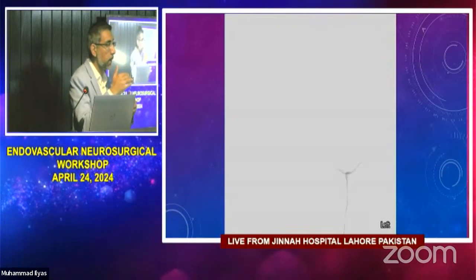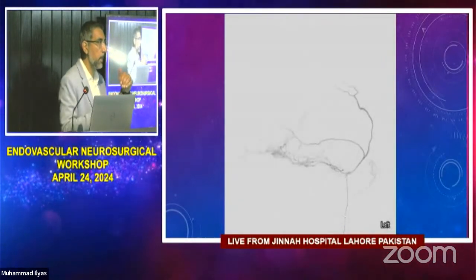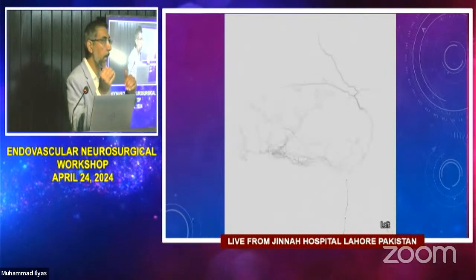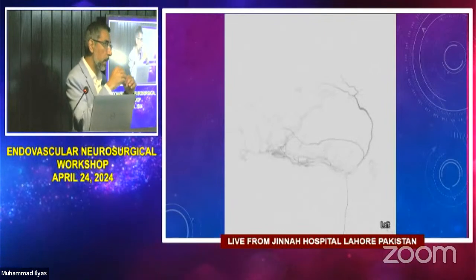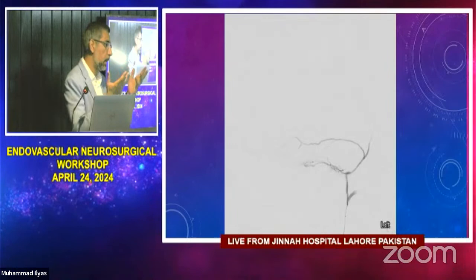So initially, when we started the procedure, we couldn't really appreciate the middle meningeal as well because the ascending pharyngeal was the more robust one. But once I embolized this, the middle meningeal became a lot more apparent. So I just had to keep pulling my catheter back through the sigmoid sinus and keep injecting Onyx till it took down the draining vein.